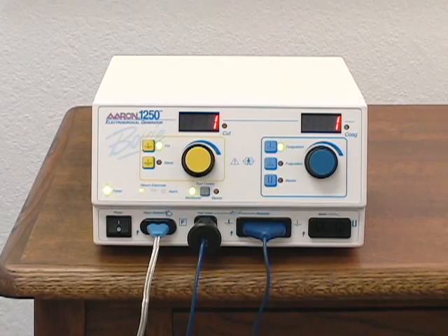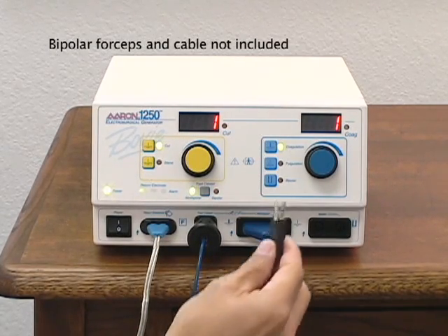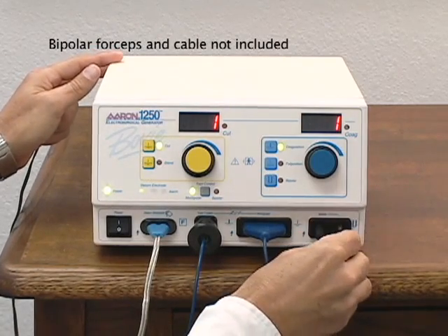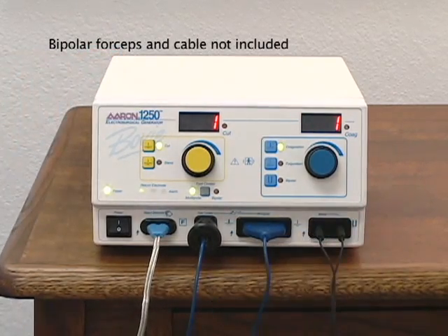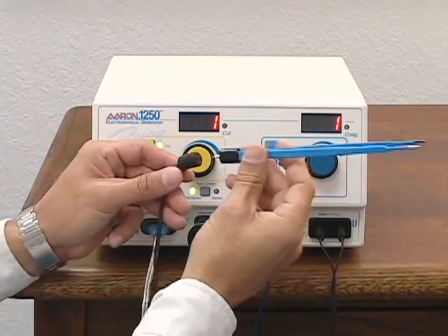To attach the optional bipolar cable, insert connectors into the receptacle marked bipolar. To connect the optional bipolar forceps, insert the prongs into the plug.